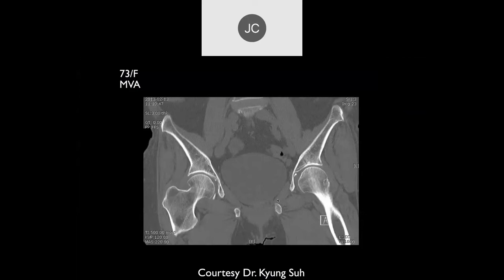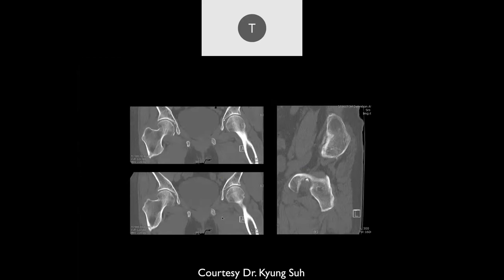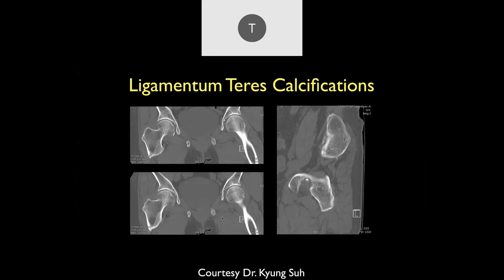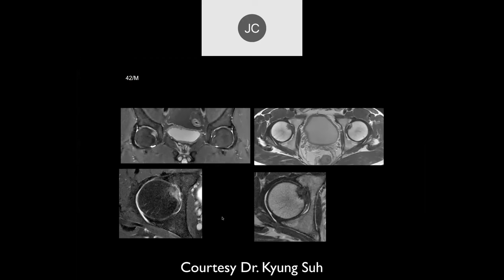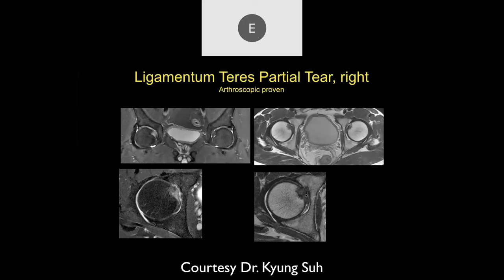MVA case — no fracture through the visualized iliac bones or femur. There is some calcification where the ligamentum teres is, presumably post-traumatic. 42-year-old male: looking at the ligamentum teres, there's increased signal that's asymmetric — could be a sprain or partial tear. It was confirmed as a partial tear arthroscopically.